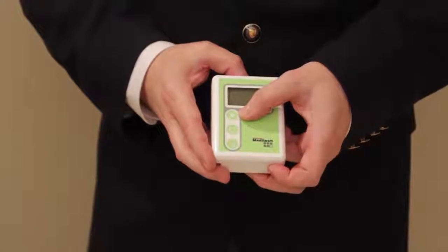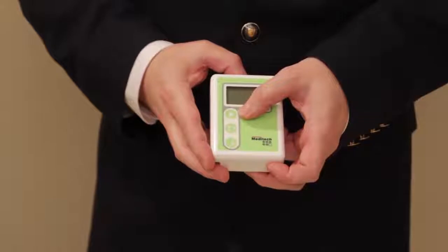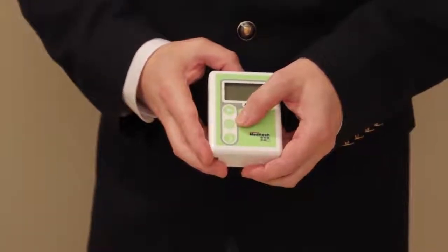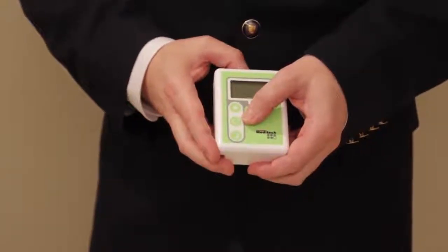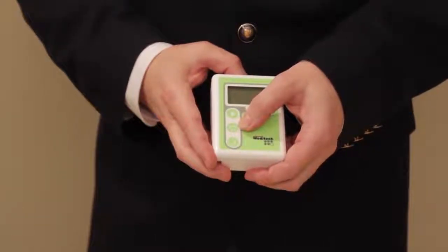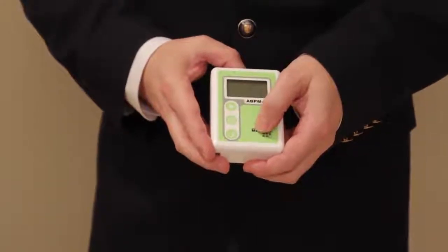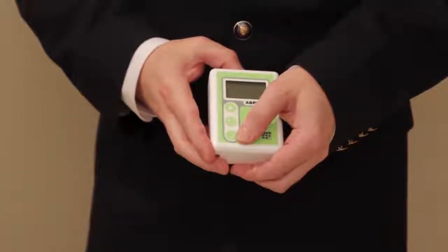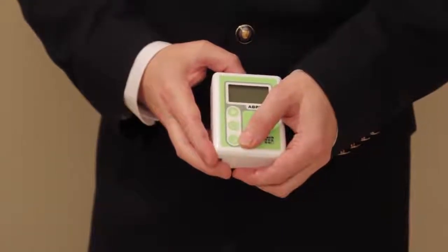This button lets you start an extra manual measurement in addition to programmed measurements. The middle button, marked with a heart, is to mark events. Whenever a patient takes a medication, has some strange feeling, goes to bed or wakes up, they can simply push this button to set an event marker, which the device will store in its memory. And the last button will let the patient switch from day to night mode if the device is so programmed.